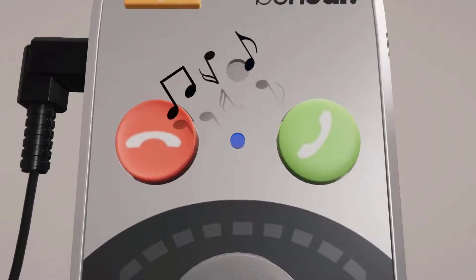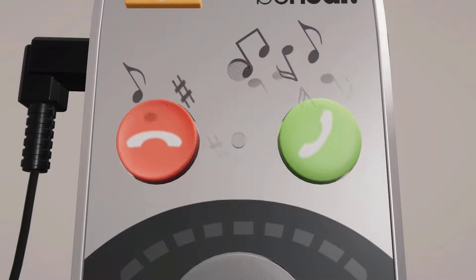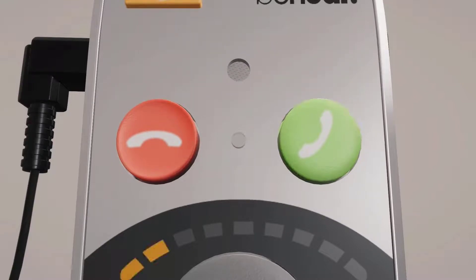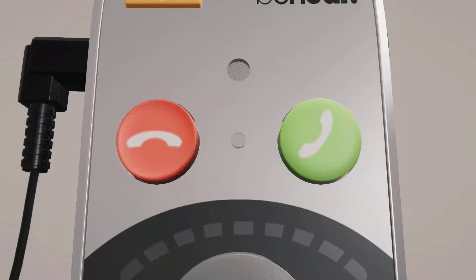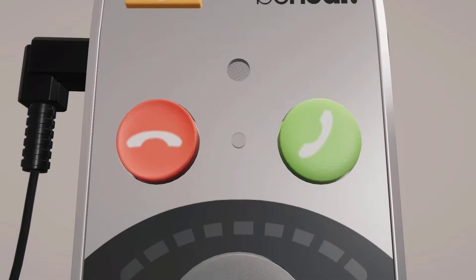To accept an incoming call, press the green button. To reject an incoming call, press the red button. To end an ongoing call, press the red button.